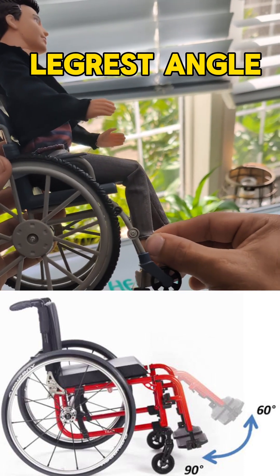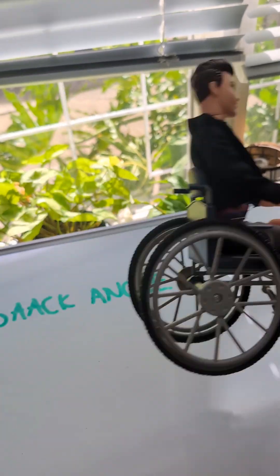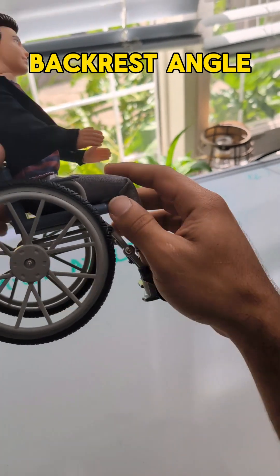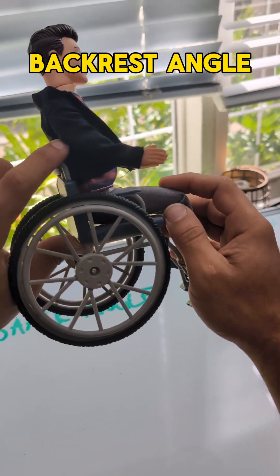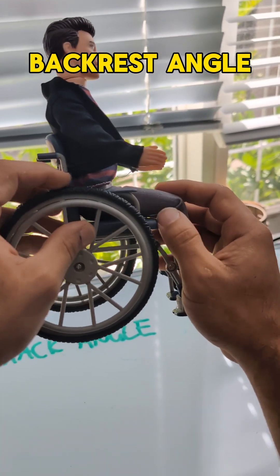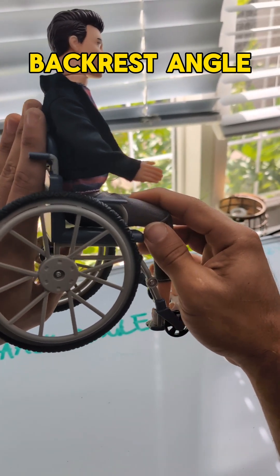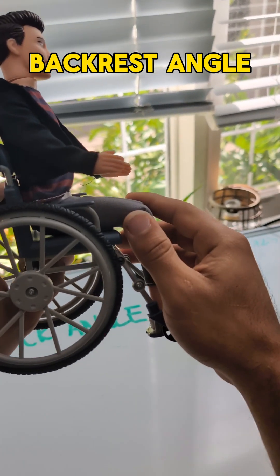A way to combat hamstring tension would be to tuck the legs in more, or perhaps change the backrest angle. Opening up the backrest angle can alleviate tension off the hamstring. You don't want to open up too much because that can also cause a slide, but playing with this angle a little can release that tension. You also want to make sure the backrest angle isn't too far upright, because if it's too upright and uncomfortable, the person will slide to release that tension.